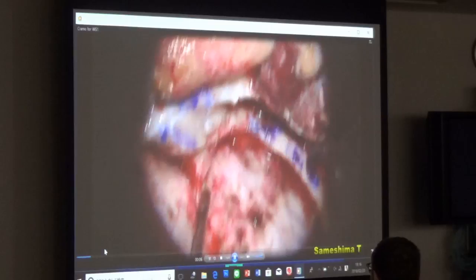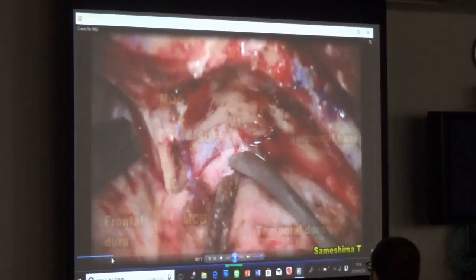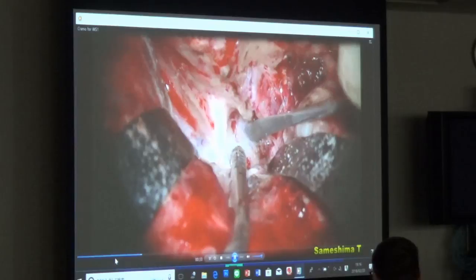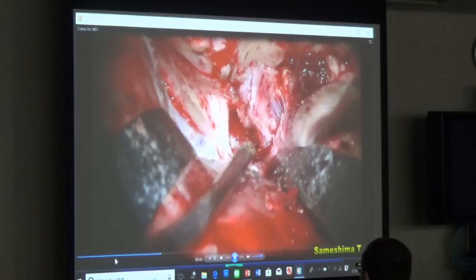And then I make a flat, so-called orbital unroofing like this. Then I elevate the dura propria from the superior orbital fissure after cutting the meningo-orbital band. So I expose the anterior clinoid under here. Then internal debulking using a high-speed drill, and I elevate it from the surrounding tissues, the tip of the anterior clinoid, and remove it like this. It's not so difficult a technique, and it's the first technique for my young colleagues.